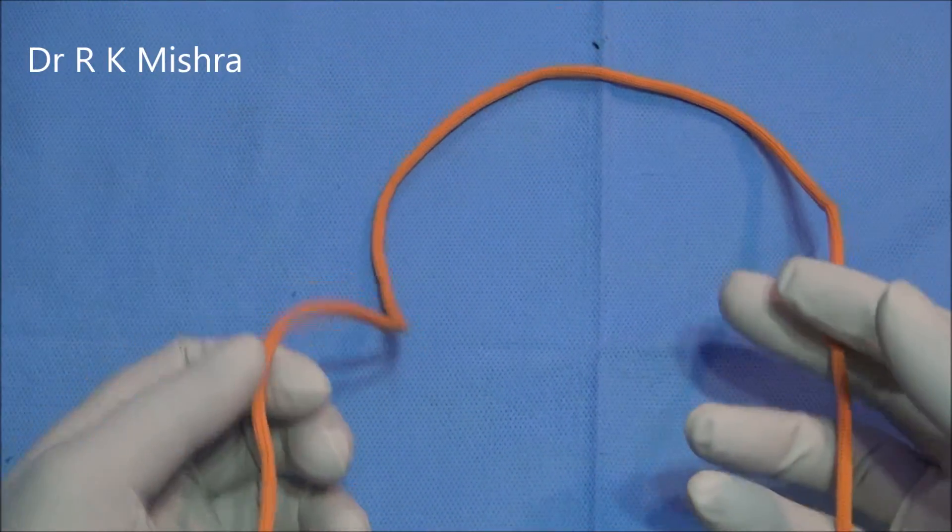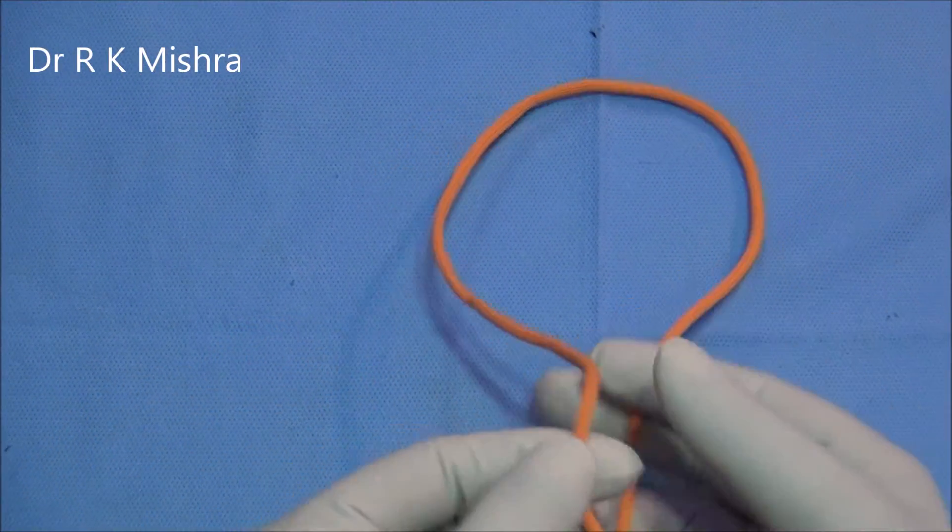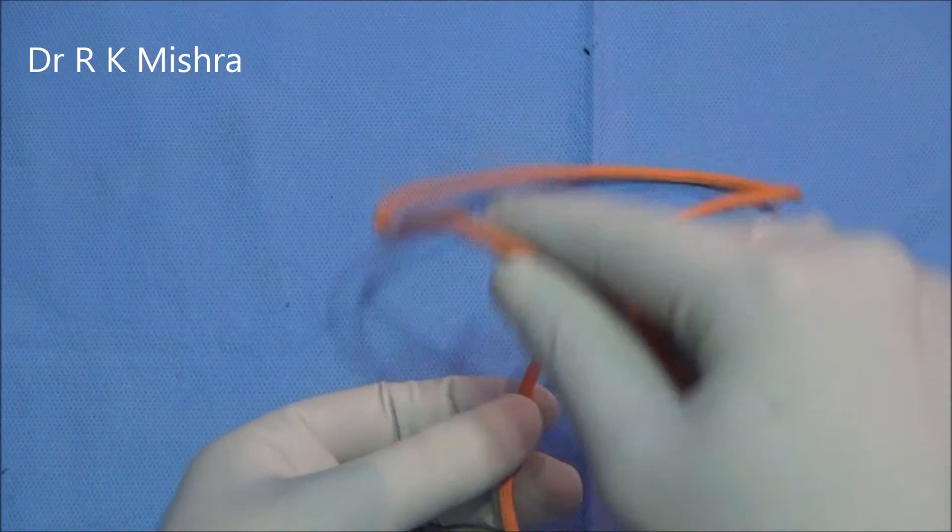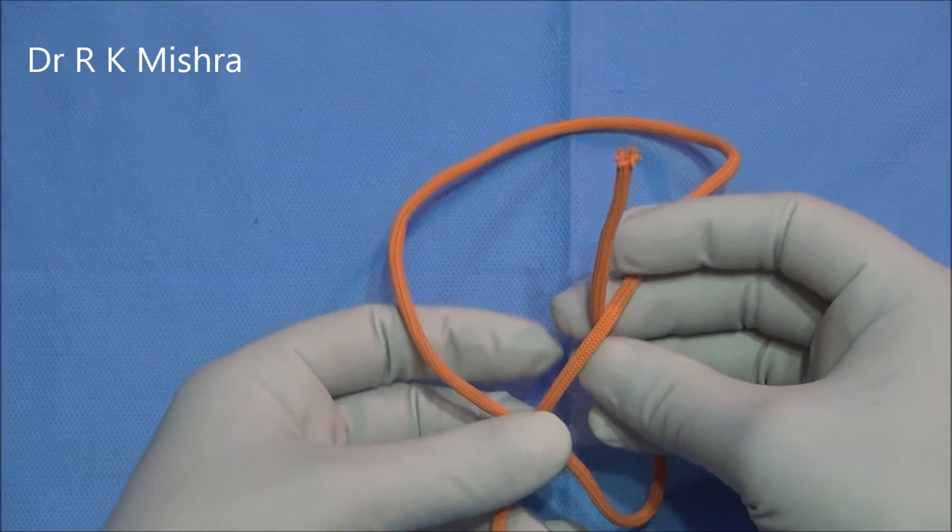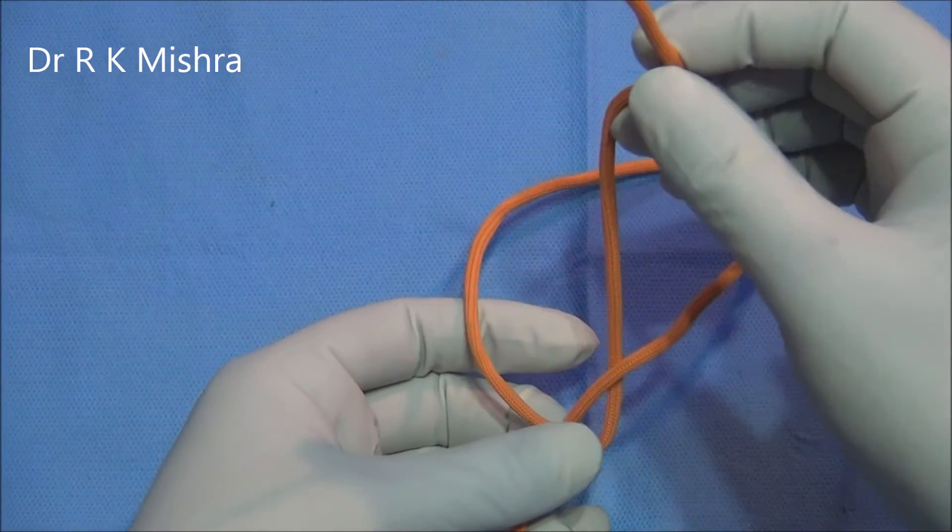This is the short limb, this is the long limb. Put the shorter over the longer, and then go from below. This creates a single hitch.